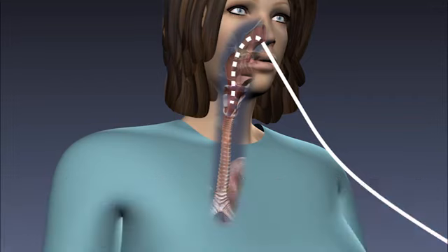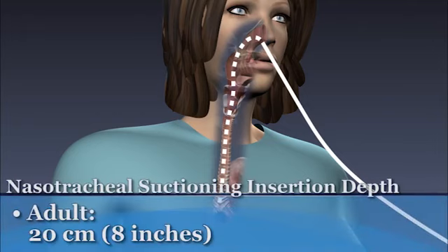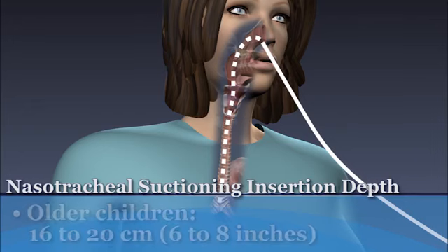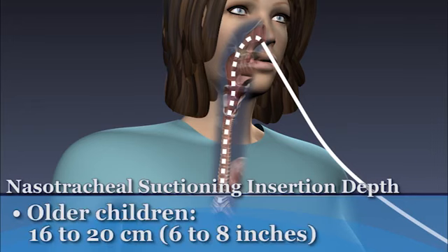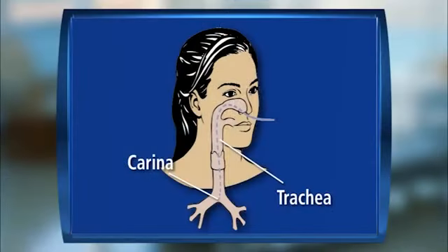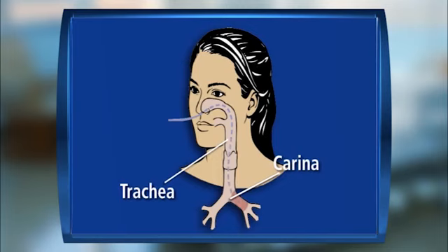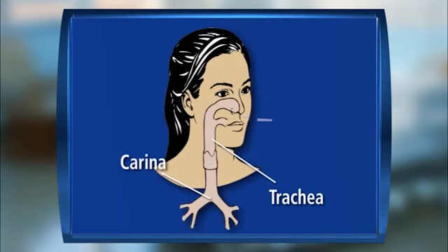If you're performing nasotracheal suctioning, insert the catheter about 20 centimeters, or 8 inches in an adult, 16 to 20 centimeters, or 6 to 8 inches in an older child, and 8 to 14 centimeters, or 3 to 5.5 inches in a young child or infant. In some instances, turning the patient's head can help you suction more effectively. Turning it to the right will help you reach the left mainstem bronchus, and turning it to the left will help you reach the right mainstem bronchus.